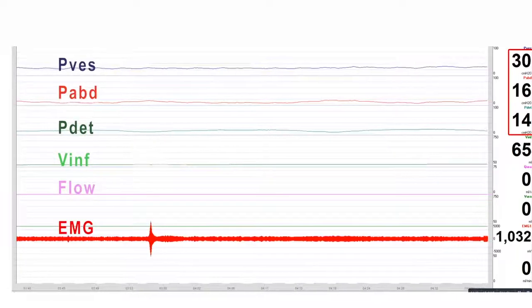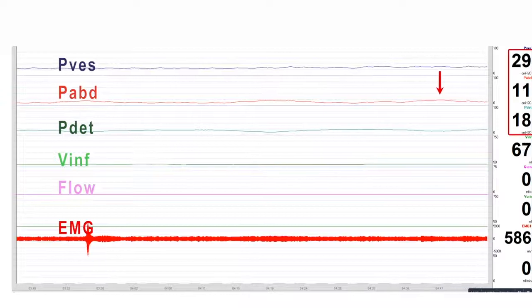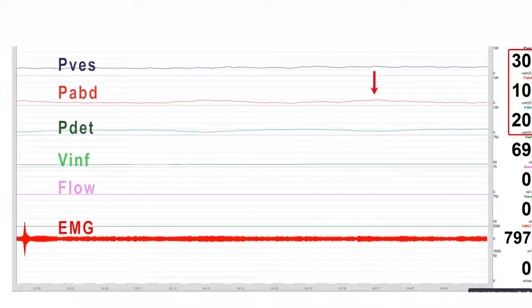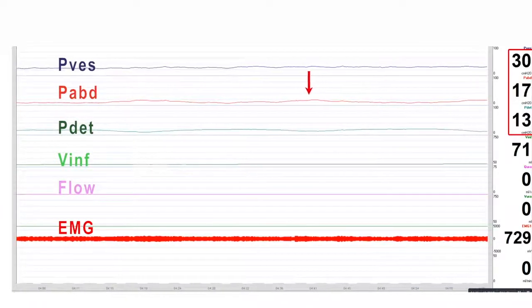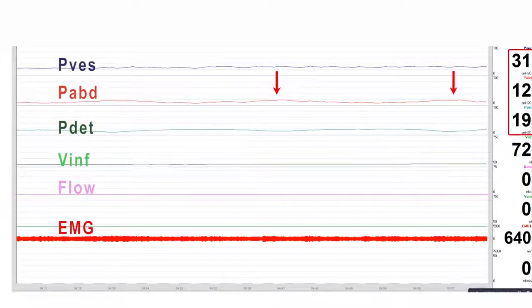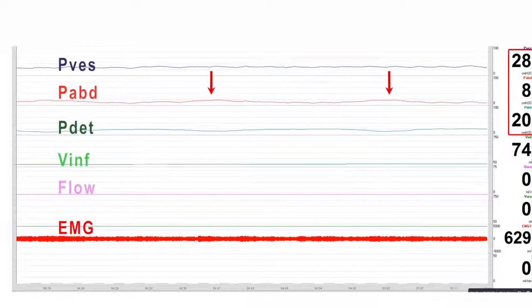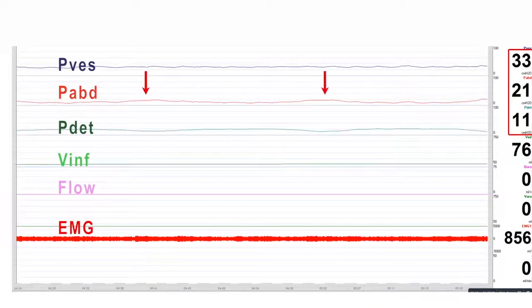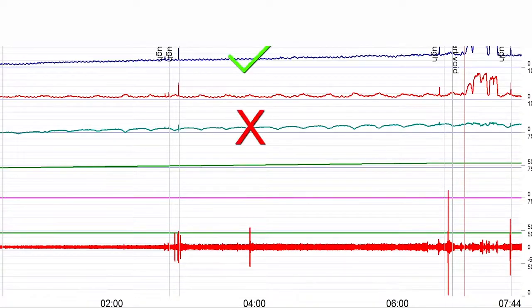In patients with neurogenic lower urinary tract dysfunction, neurogenic bowel dysfunction is not uncommon. During urodynamic study, rectal overactivity may be present, causing phasic pressure rises. In this situation, the detrusor pressure is no longer relevant, and the observation of intravesical pressure becomes important and can inform about the bladder pressure situation.